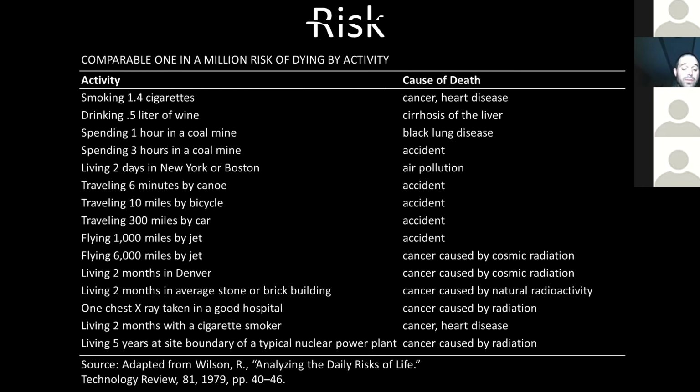My best advice for what to tell your patients and how to train your staff for how to talk to patients about dose is acknowledge that there is a risk, yes, but also explain that it's extremely low. We've selected the lowest, most dose-efficient machines and protocols to give us the diagnostic information we need to decide your treatment. And the risks of not obtaining that information in terms of additional possible infection or complications of treatment vastly outweigh the small added risk of cancer.